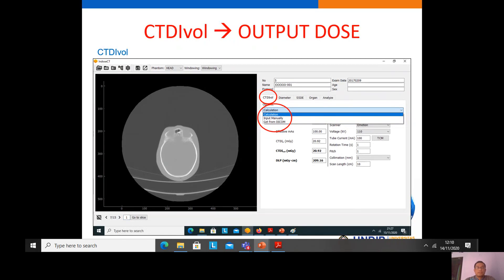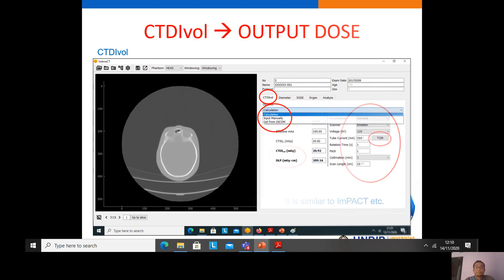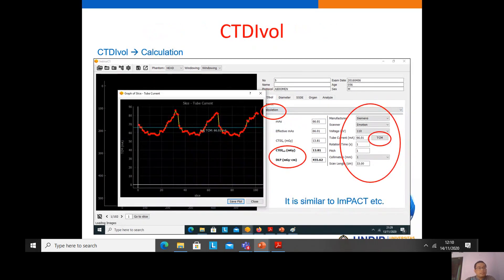The first feature is to estimate the CTDIvol. CTDIvol is the metric for quantifying the output dose, and patient dose is estimated based on this CTDIvol. In IndusCT, there are three options to estimate the CTDIvol: using calculation, getting it from the DICOM info, or inputting the CTDIvol manually.